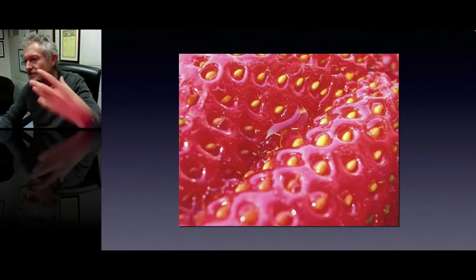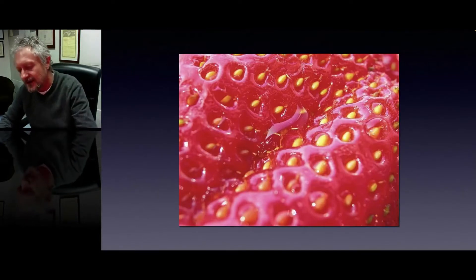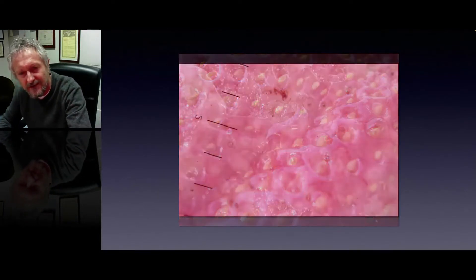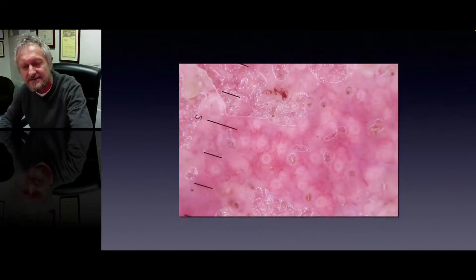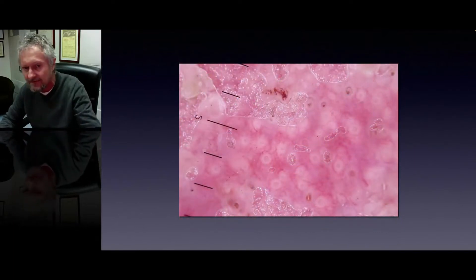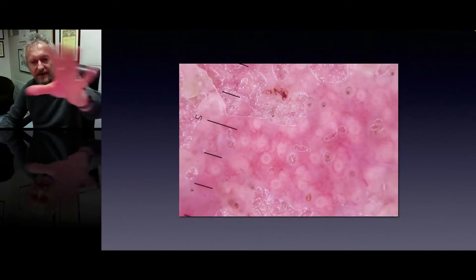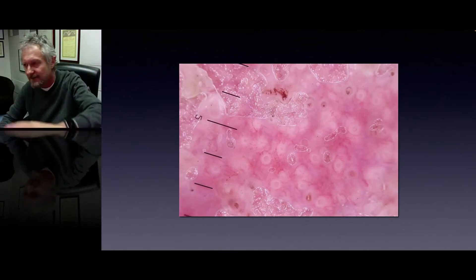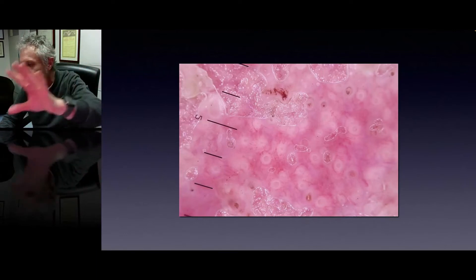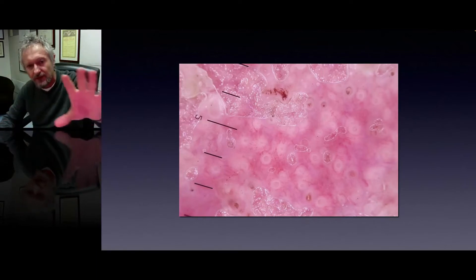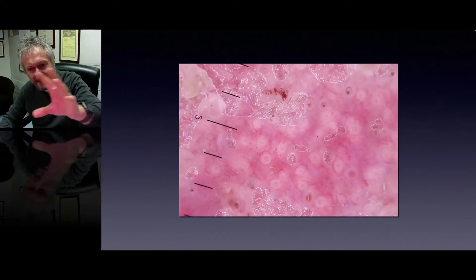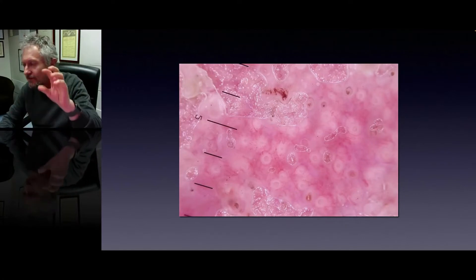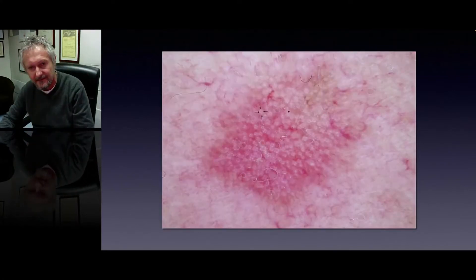The most obvious morphology in dermoscopy of actinic keratosis is the presence of the strawberry pattern, typified by this reticular red pseudo-network with reticular vessels and white follicles in the center.